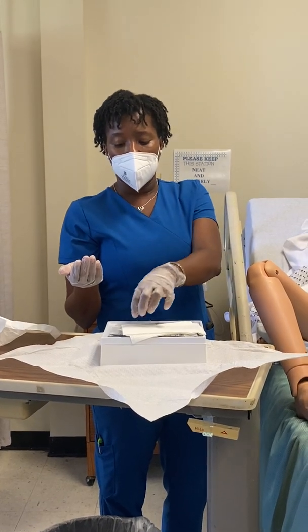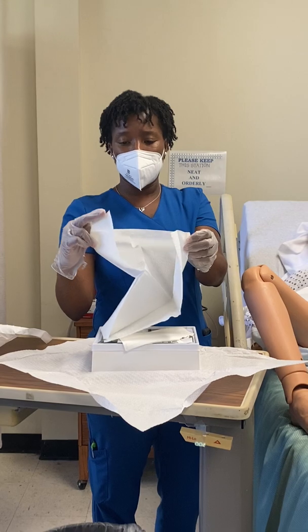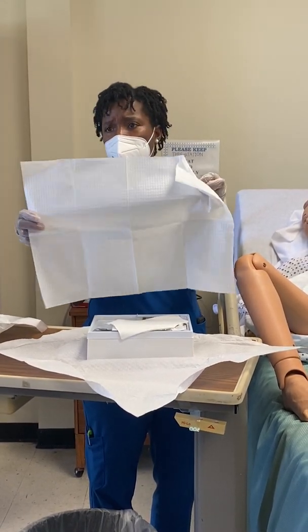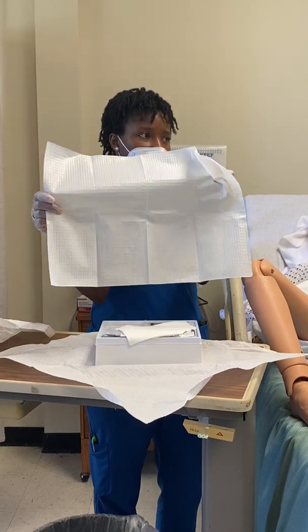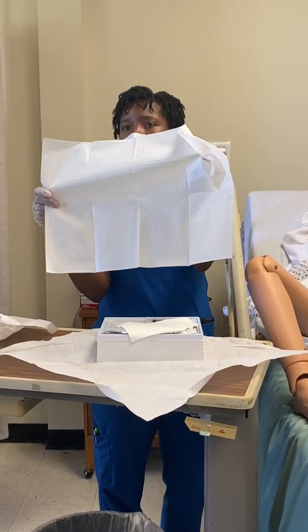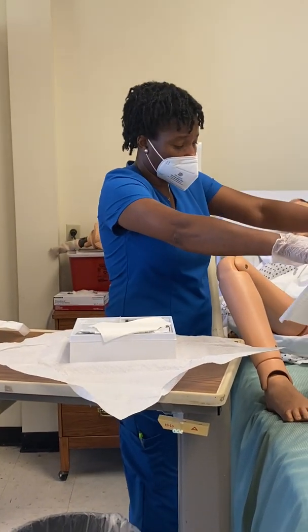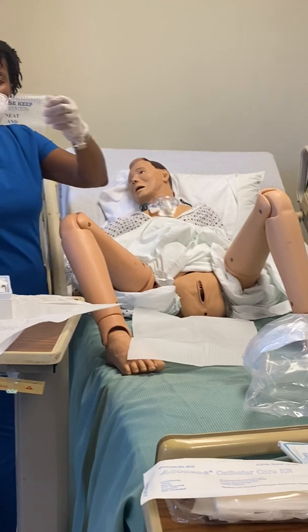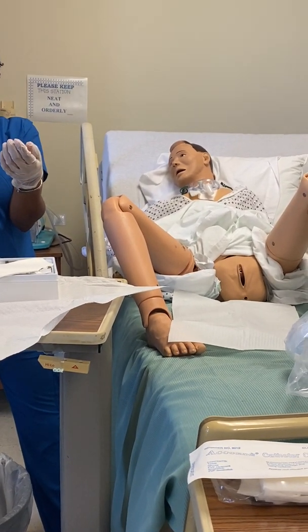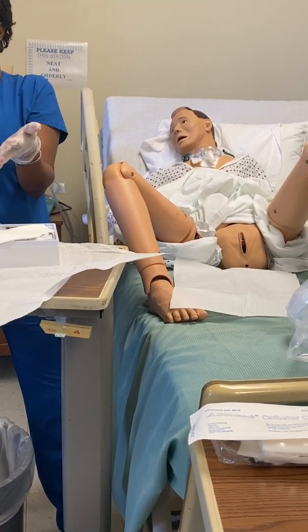Now, this is a little barrier that goes underneath the patient to protect from moisture hitting the bed. Do you see this shiny side? That's right. Shiny side down. Because we want it to collect whatever it can collect. And I'm just going to lay it there. Why? I don't want to take the risk of contamination. Could I move it to the center? I could, because remember now everything's sterile.